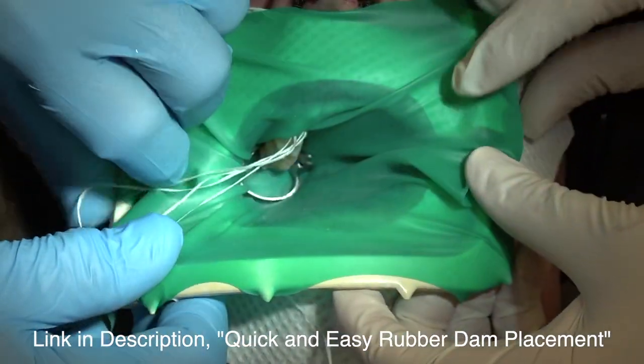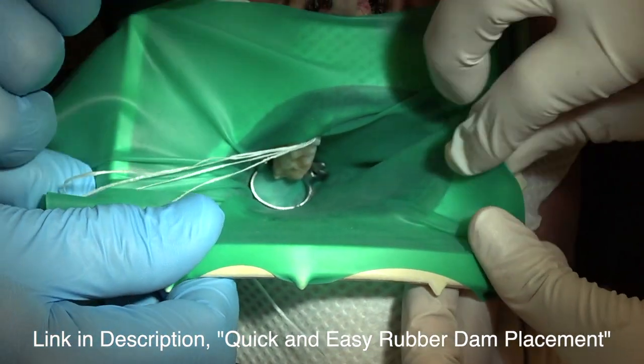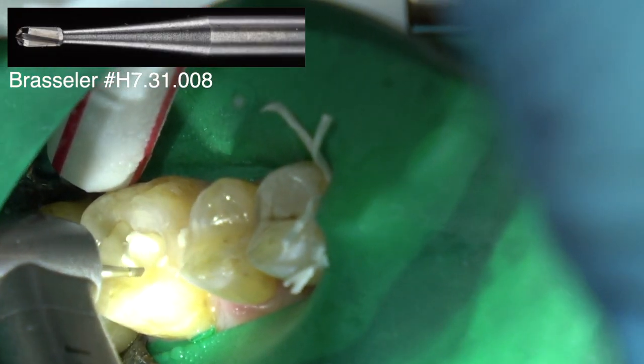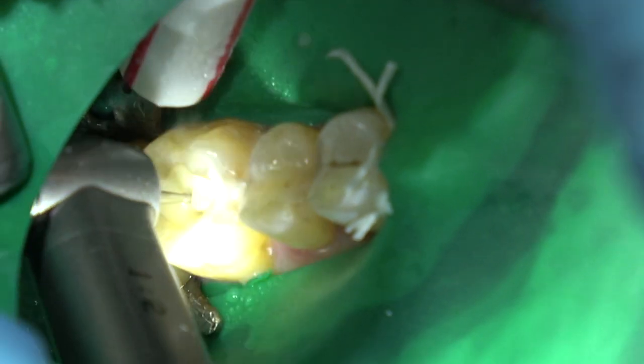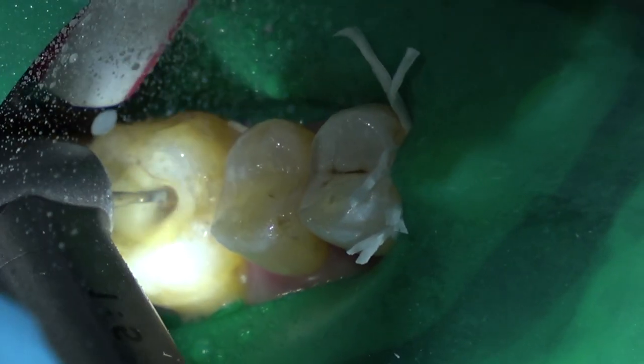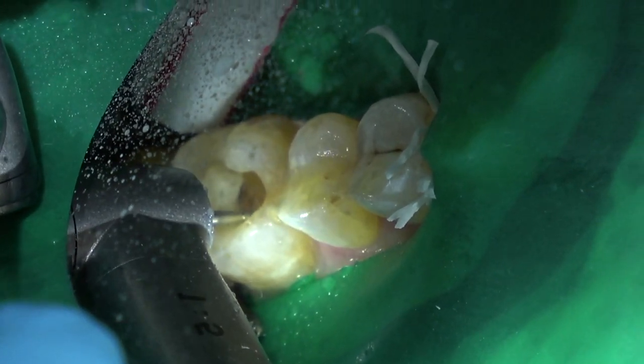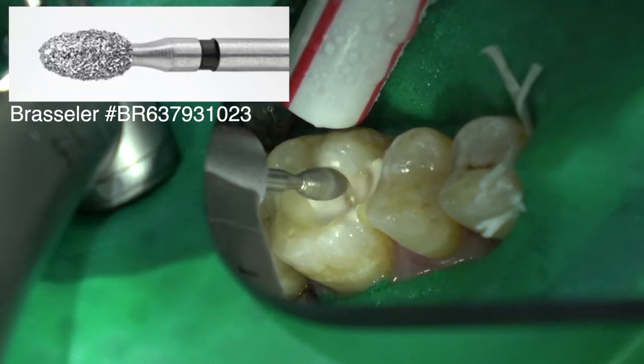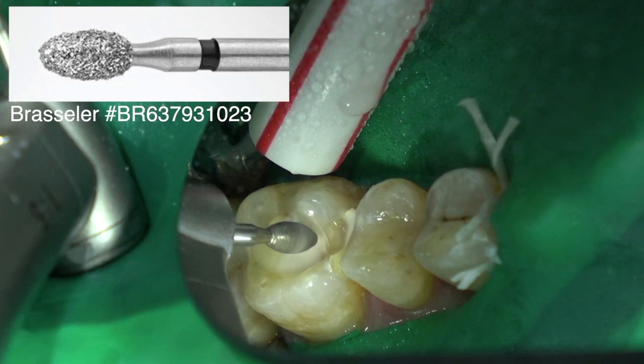Know how to use this rubber dam technique. Like I said in the previous video, it takes me about 15 seconds to place this rubber dam using this technique. I'm cleaning out the decay, removing the old filling, and this tooth was painful to biting pressure, extremely painful to biting pressure, and had a crack into the nerve of the tooth.